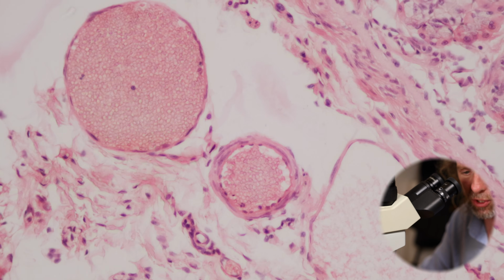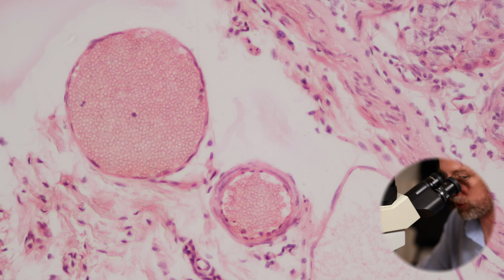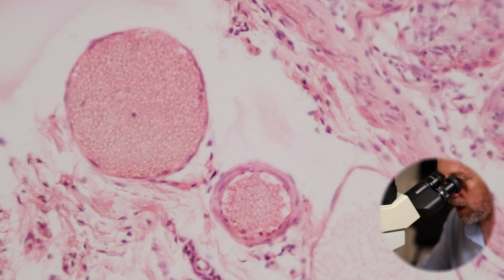Look at these three tubes, aren't they pretty? So we've got two blood vessels there. One's got a thicker wall, one's got a thinner wall. We can see them filled with blood cells which aren't staining. So we have a little venule there and a little artery. The little arteriole is the one with the thicker wall.